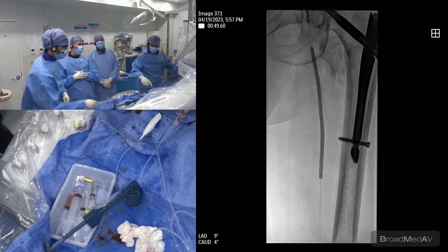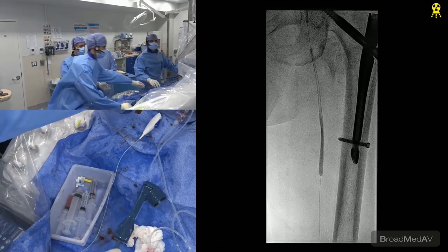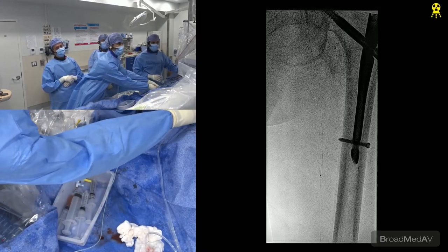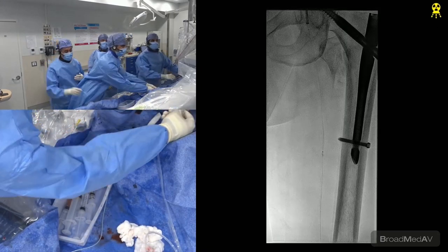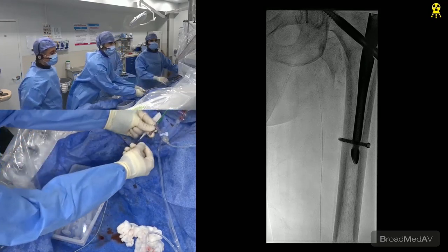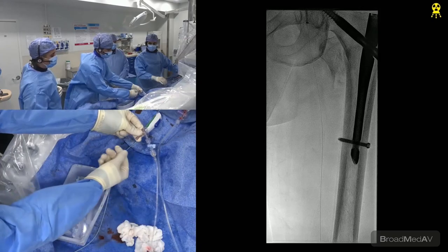Agreed. It's mostly post-stenotic dilatation. If you see that, then it makes sense. But you remember, I think the more significant lesion was distal. That's why our proximal gradient wasn't bad. Right. But then after we did our proximal gradient, it was a huge step up. So now we're going to do another quick pressure wire after taking a picture.